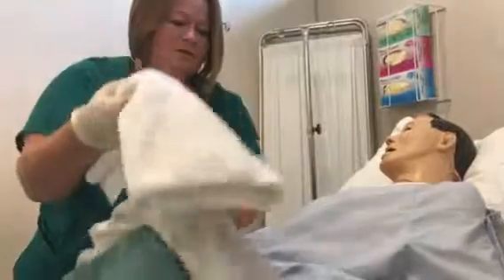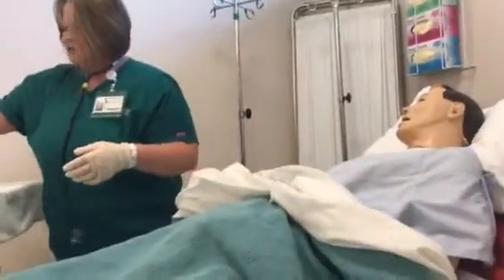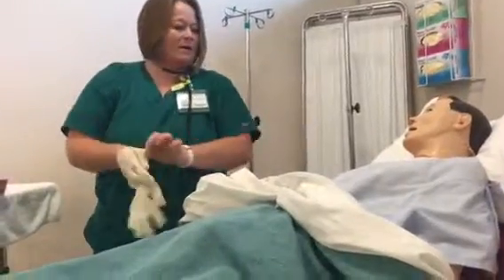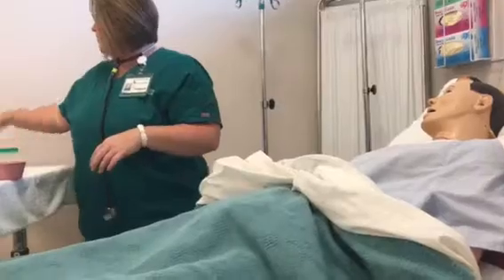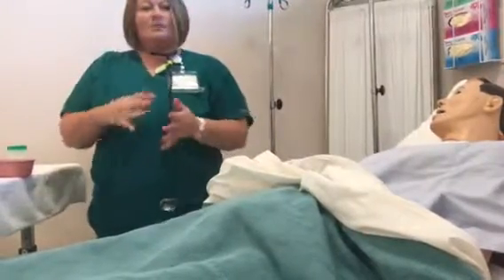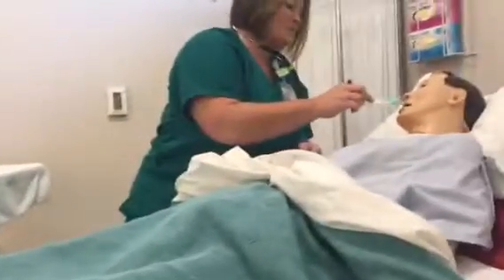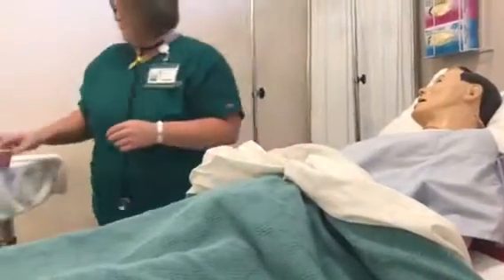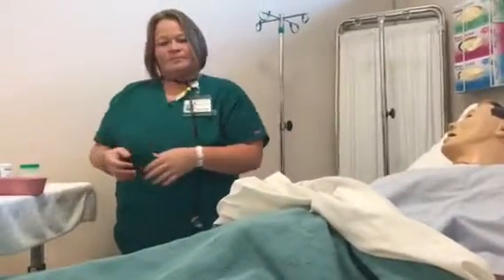So now, get you covered up here. Dispose of this in the appropriate location. I'm going to take off my gloves. I'm just going to wash my hands. So I'm going to perform hygiene. I'm going to apply gloves, reapply gloves. I'm going to provide oral care. So we're going to get you a little freshened up there. And then I'm going to take off my gloves. I'm going to wash my hands.